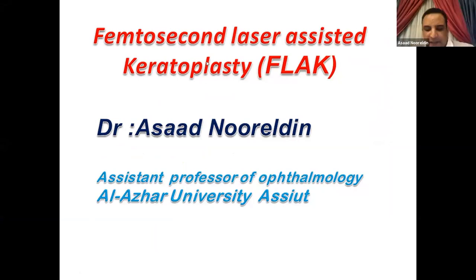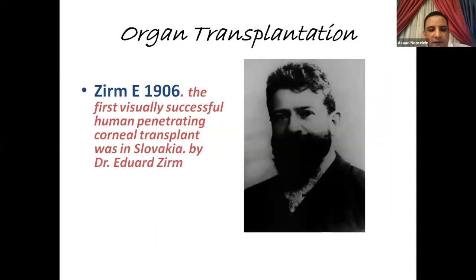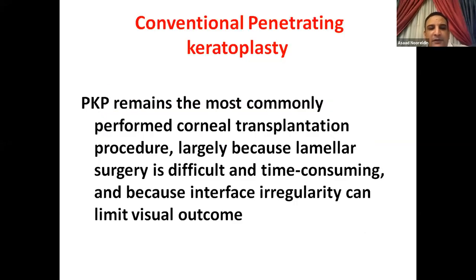Femtosecond laser assisted keratoplasty. We will speak about femtosecond laser assisted keratoplasty and compare it with conventional. The first visually successful human penetrating corneal transplant was performed in Slovakia by Eduard Zirm. Conventional penetrating keratoplasty remains the most commonly performed corneal transplantation procedure, largely because lamellar surgery is difficult, time consuming, and because the interface irregularity can limit the visual outcome.